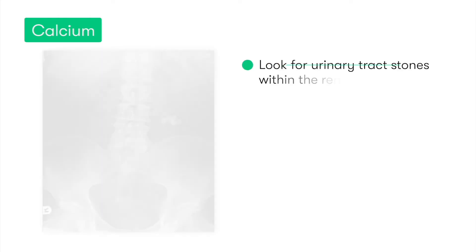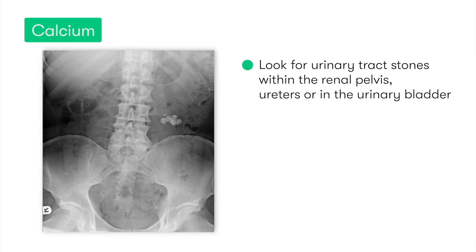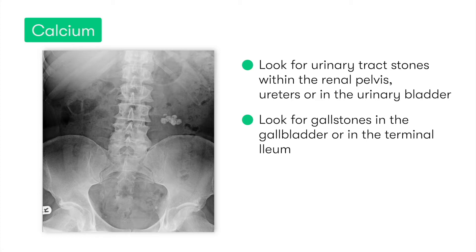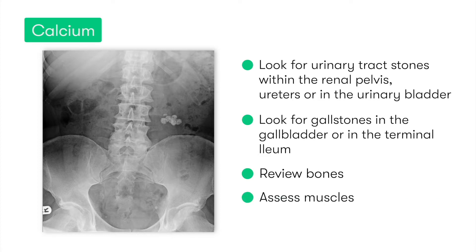Moving on to C for calcium: this mainly involves assessing for the presence of any calcified urinary tract stones within the renal pelvis, along the course of the ureters, or within the urinary bladder. We can also look for calcified gallstones present either in the gallbladder, or in the case of gallstone ileus, whether a large stone has become lodged within the terminal ileum.